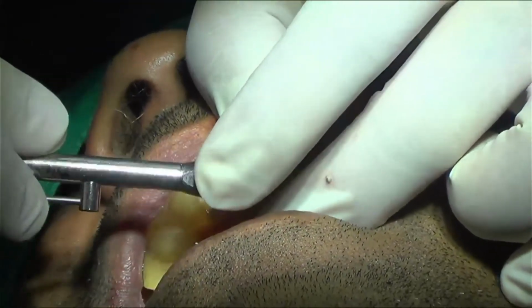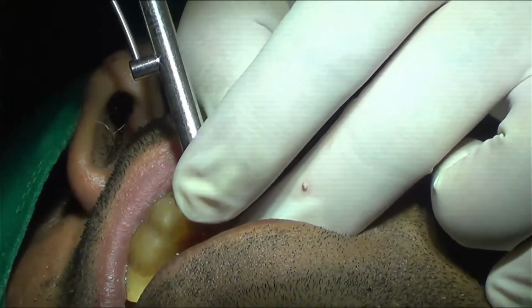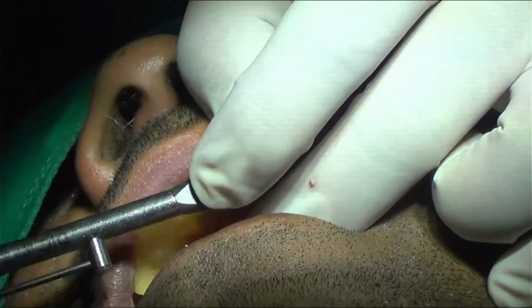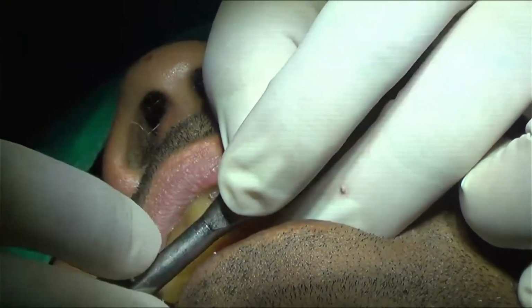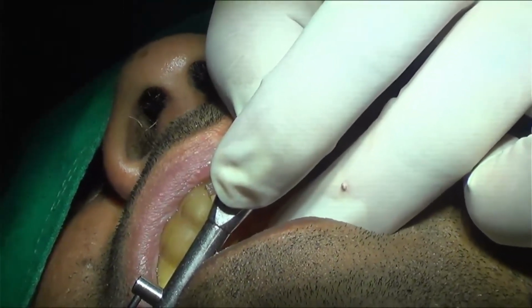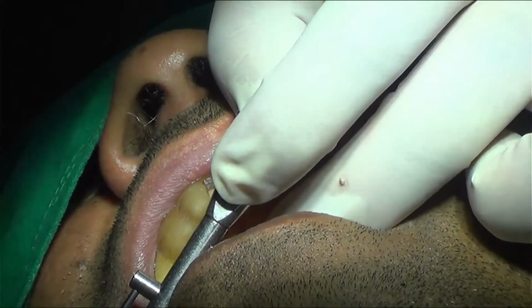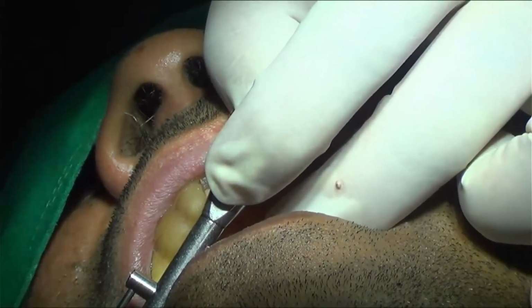Now, how we should torque and detorque is, if we have detorqued for 1, 2, 3, then we should wait for 1 minute. We should wait minimum for 1 minute and allow the bone to expand. If any heat is there, it will get dissipated in that amount of time. If we detorque and torque simultaneously, then it can become a problem.